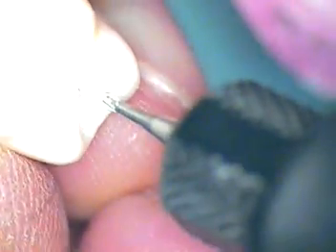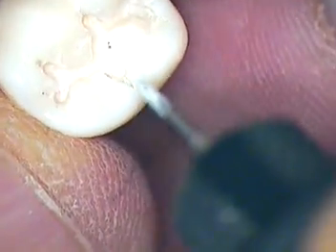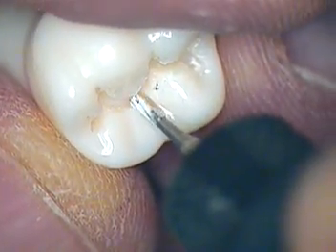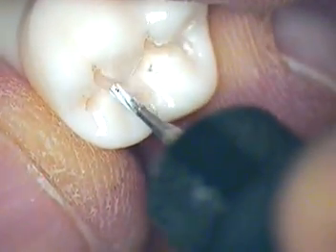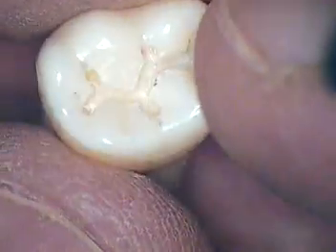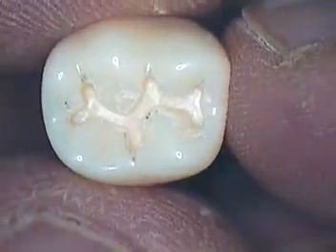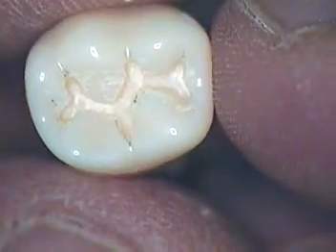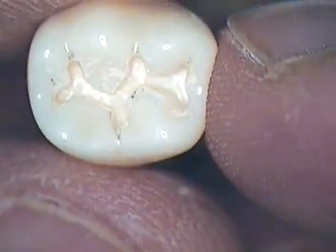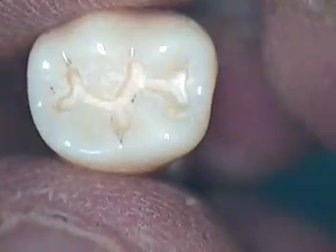You can also drag it through there and just feel where it's binding. We should round things — it's important to make uniformity. Like this little corner here, that one can be rounded and smooth. And when you're done, you're done. This is Dr. Jerry Cuomo with the Class 1 tooth preparation design on tooth number 19 — lower first permanent mandibular left molar. Take care and keep practicing. We'll see you in class.